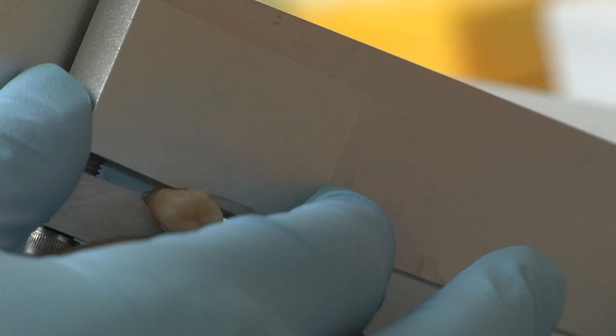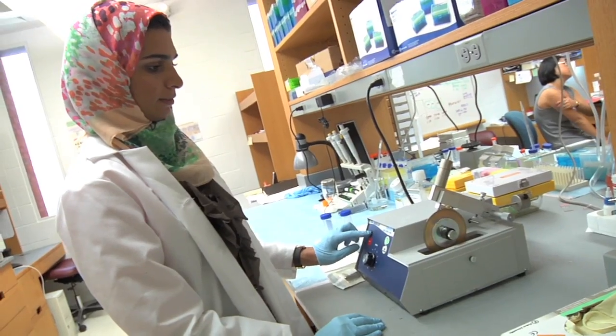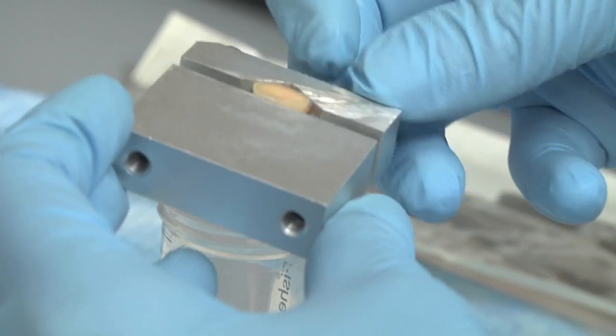My research starts on getting extracted third molars from the dental surgery clinic. I take these teeth, disinfect them, and then start isolating dental tissue.